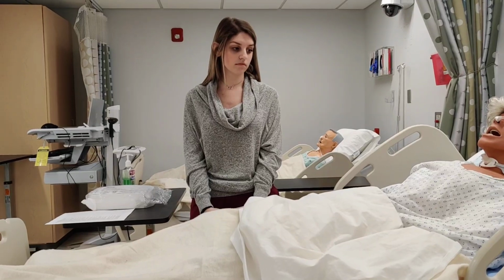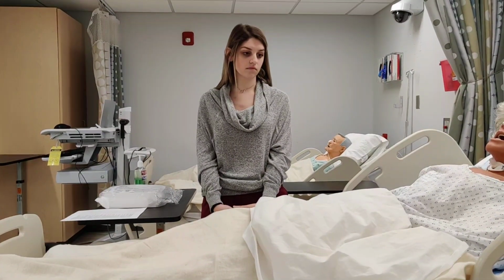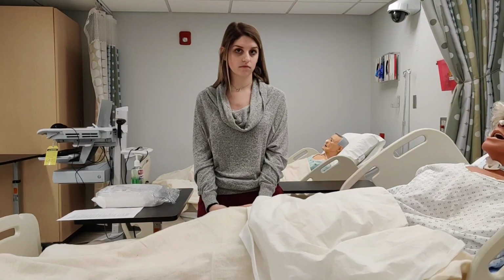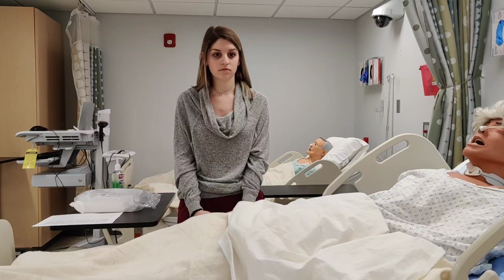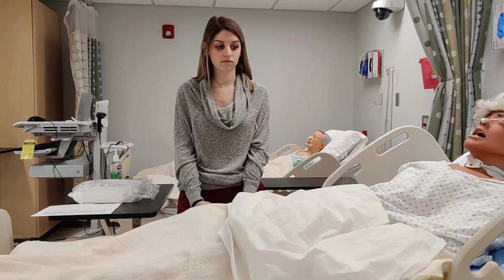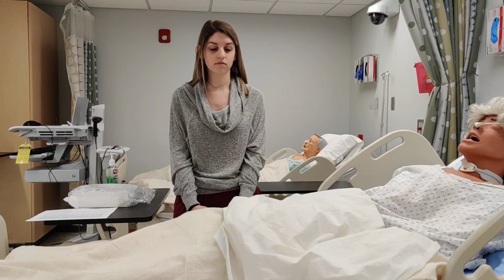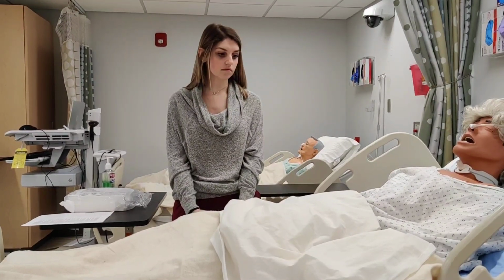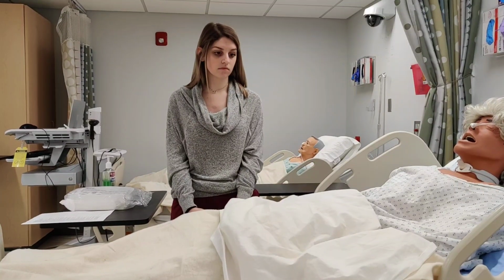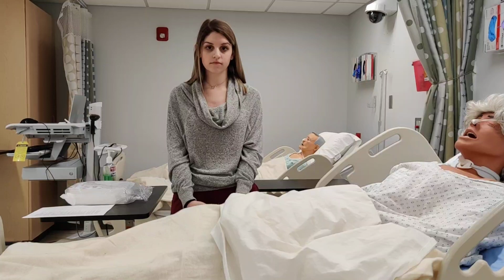So the first thing that Gabby's going to do prior to entering the room is she's going to look up the orders in the EHR. Today she's not going to physically do that, but we want you to be aware that those orders do need to be in place before you can place a Foley catheter. So she looked at the orders, and it does say to place an indwelling urinary catheter, so we're going to go forward with placing that.